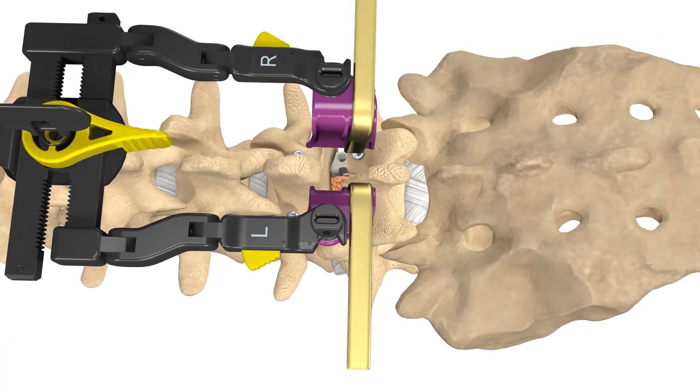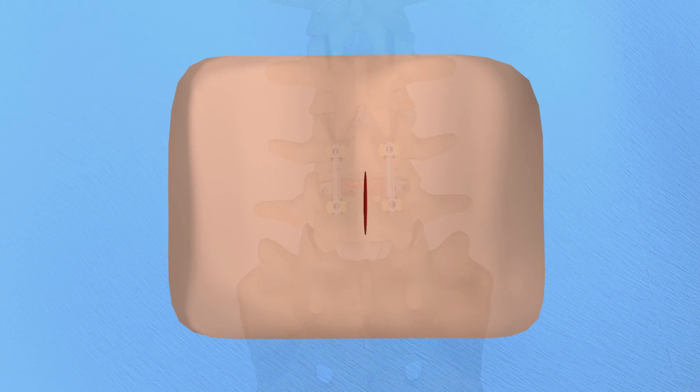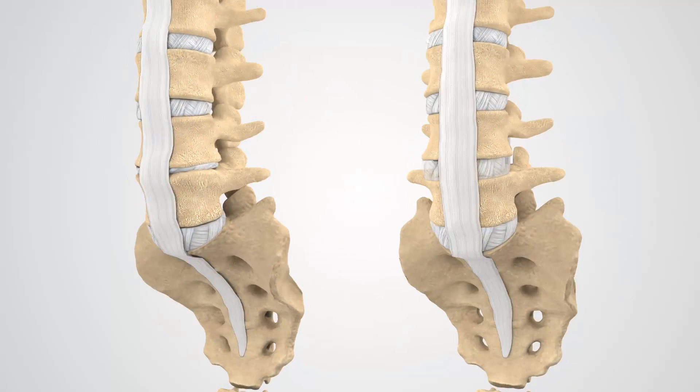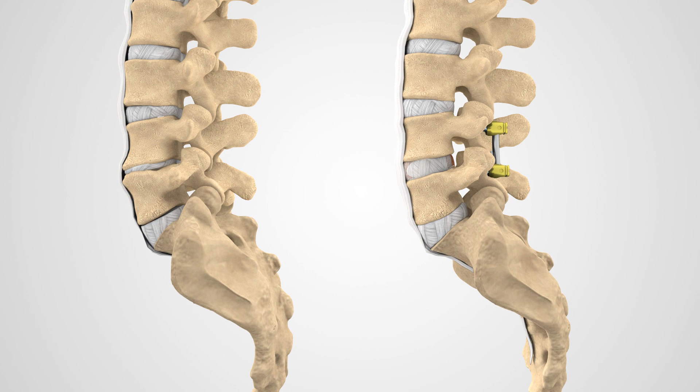In order to stabilize the spine, once bone and the disc have been removed, the screws will be connected with a rod. This stabilization will encourage bone to grow and fuse the vertebrae together.